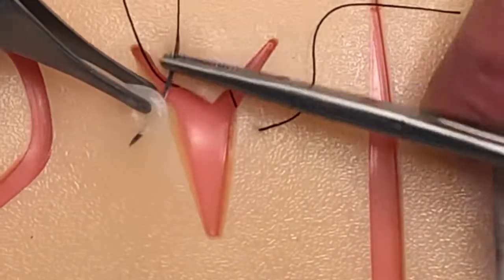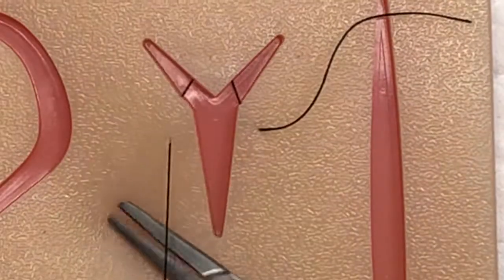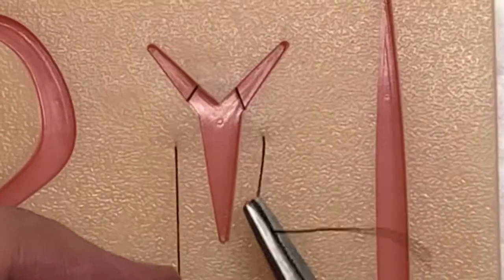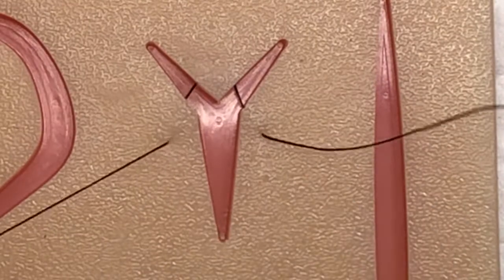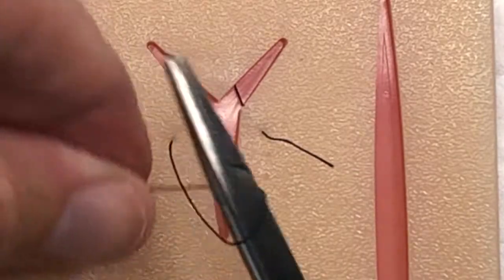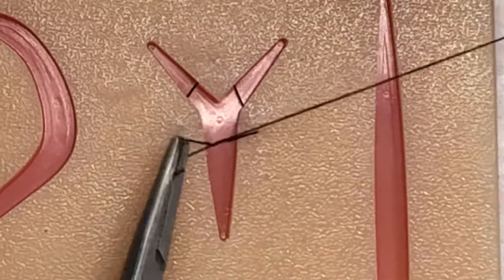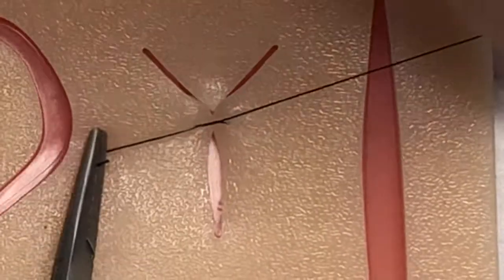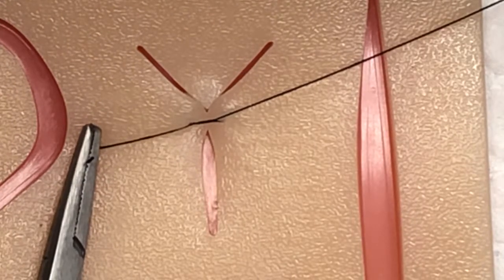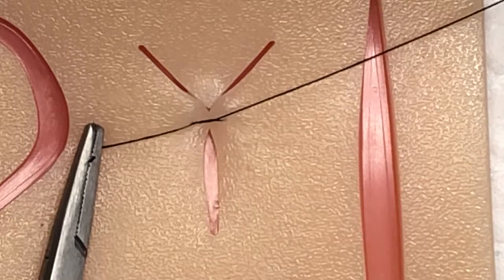Try to strive for symmetry here. So what have I got? Well, this is kind of like your horizontal mattress sutures. And then what I'm going to do is do my instrument throw, two loops, pull across. See what that does? It brings it all together. So with a single suture, you're able to bring the edges together.